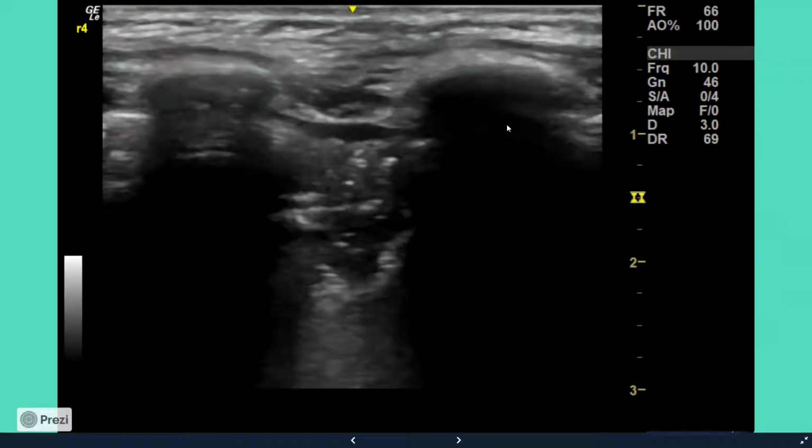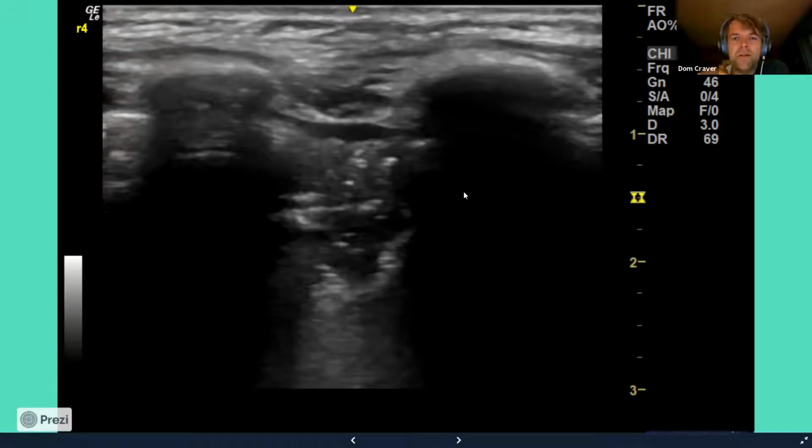Yep, great. So here's the rib. There's a rib, there's a rib shadow. Here's the pleural line here. Rib shadow. Here's normal pleura. There's a nice little A line there, and there's probably a starting normal pleura here. And then we get this small consolidation just coming here, and behind it is a B line. And if I just move to the next image.